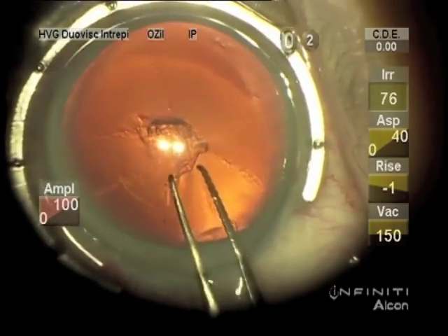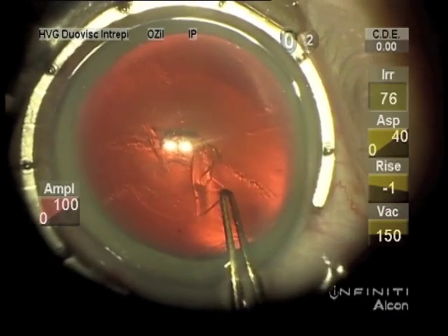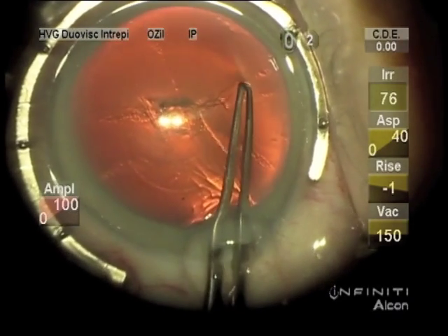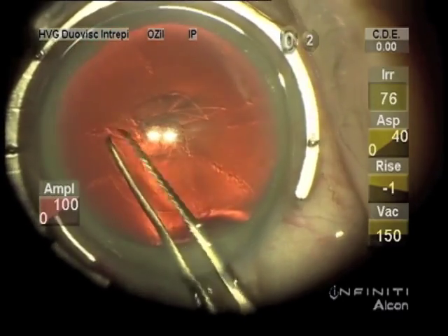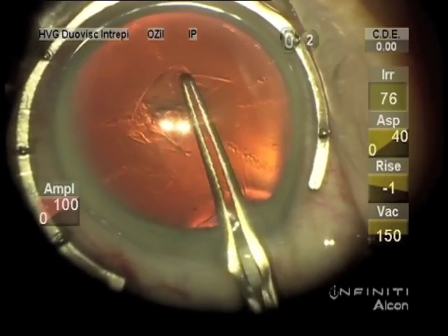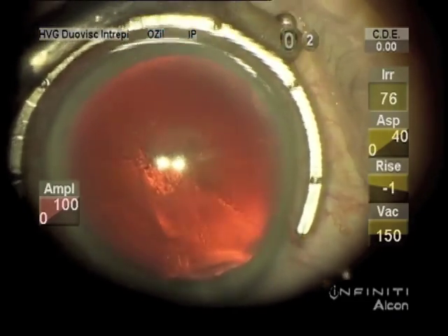I like to stop right there at the sub-incisional to re-grasp where you can get an easy grasp of the capsule, and then enough re-grasps to get a central circular opening.